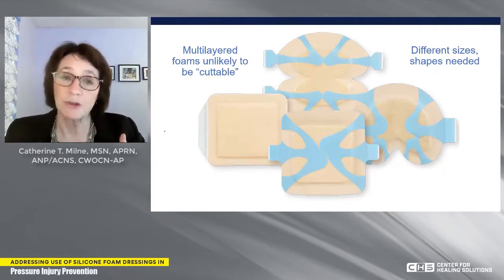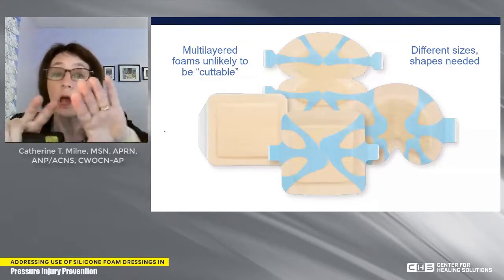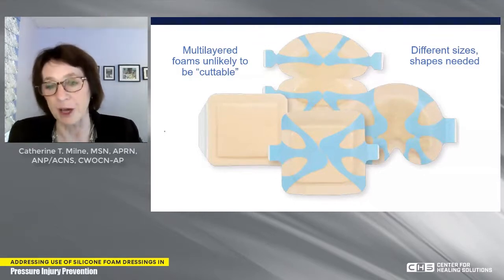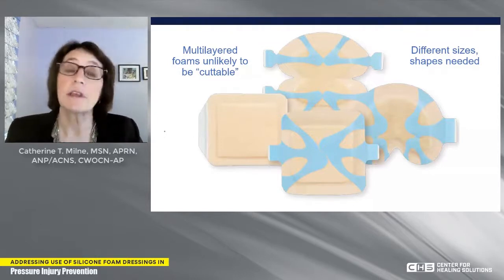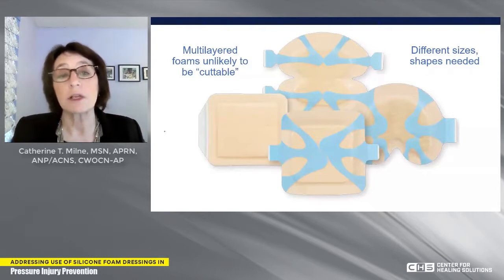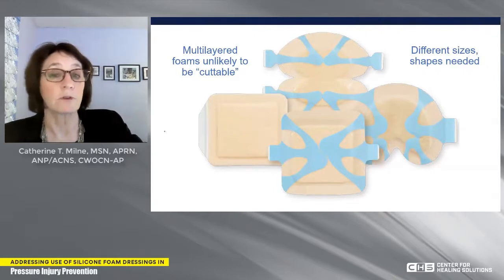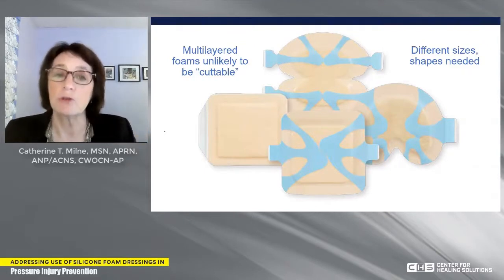Again, when we talked about stress and strain, it's not only what you want to prevent right at the area of concern, but the strain that you're going to see further out. So for example, you could see over on the right, you have a sacral dressing. It is shaped like a buttocks. It will do the right half, the left half, and the middle. If you're just worried about the middle, you have to think about the stress and the strain on the right and the left buttocks, so you need a dressing that's going to address that. Over on the top is a heel dressing. Your heel has very little surface area, so you have to spread that out, pressure equals force over area. You have to be able to redistribute that well. And so you do need different shapes.